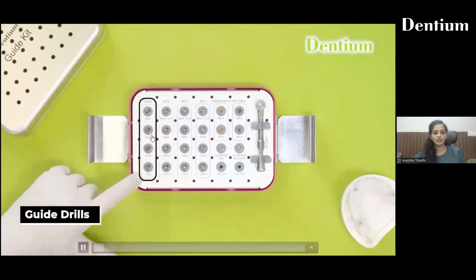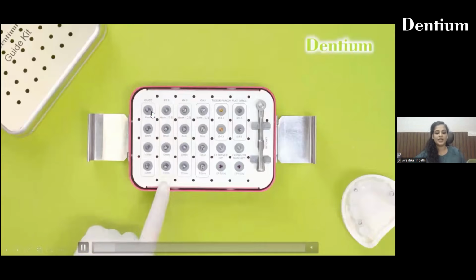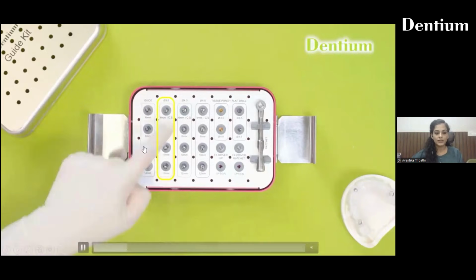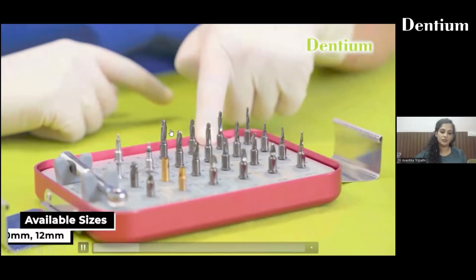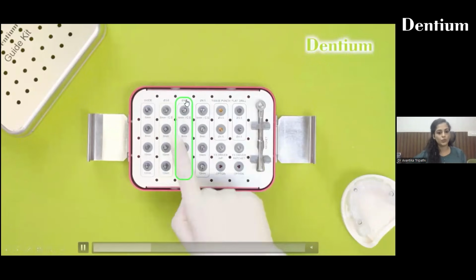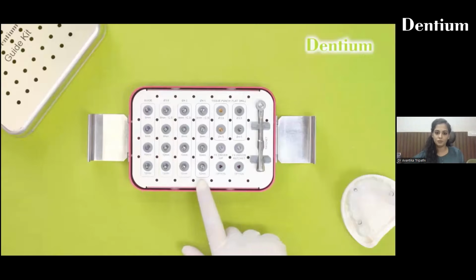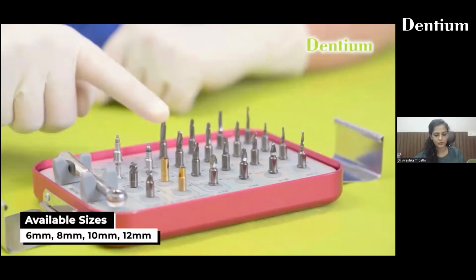Now this is the surgical guide kit. There are 6 mm, 8 mm, 10 mm and 12 mm drills of each diameter. This is the guide drill. Then the 3.6 mm drill with the same lengths available. Then 4 mm diameter drills with 6, 8, 10, 12. And then coming to the 4.5 mm drills, with 6, 8, 10 and 12 mm length drills available.